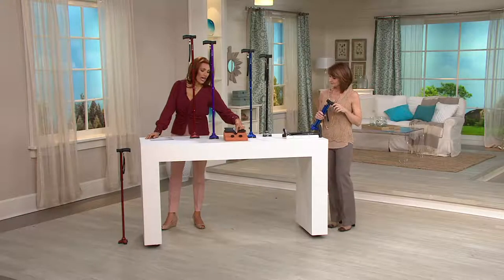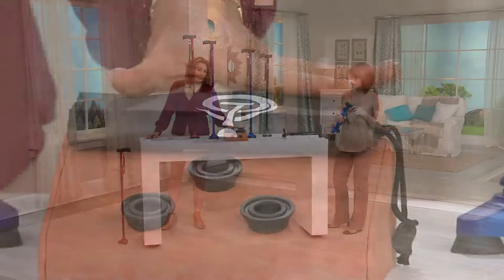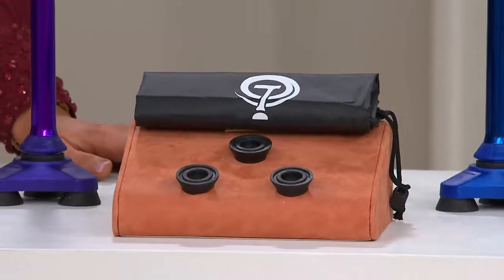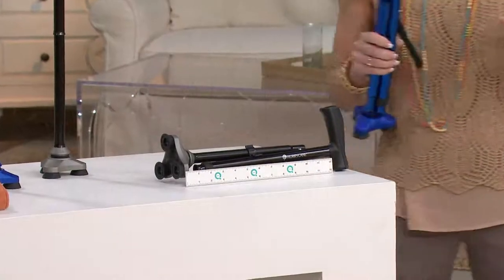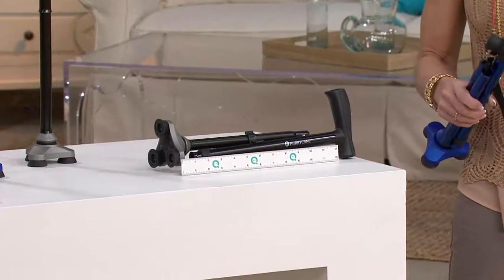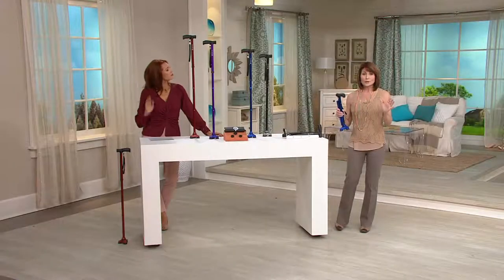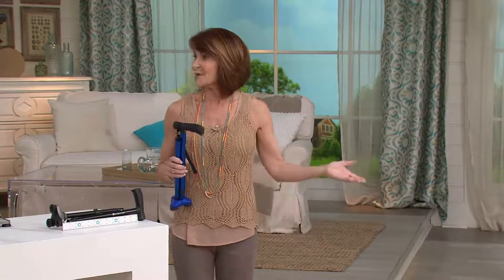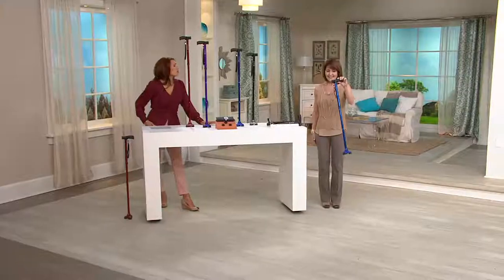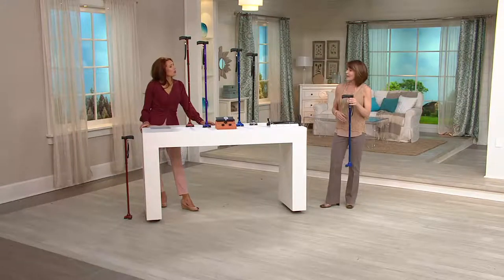You're going to get three extra foot pads and also the carrying bag, because it does fold down. It folds down to about 13 and three-quarters inches. You can throw it in the bag, or you can let it stand alone — because it is an all-terrain cane that can stand alone. I've got so much positive feedback from people who got it for their mom or dad, who were apprehensive at first but now love it. It holds 350 pounds, so very substantial.